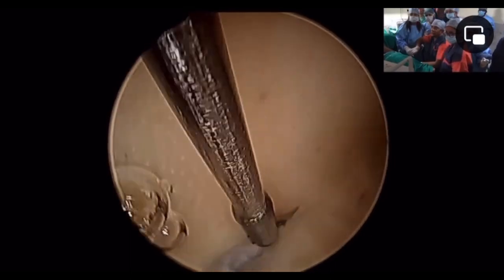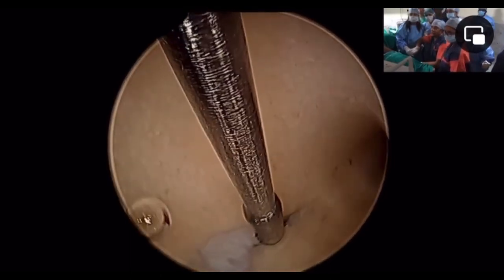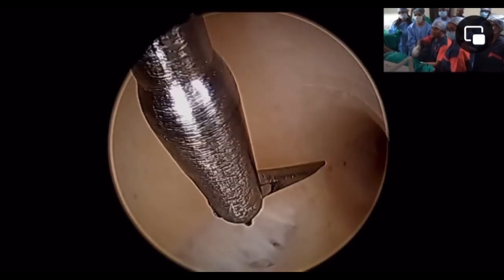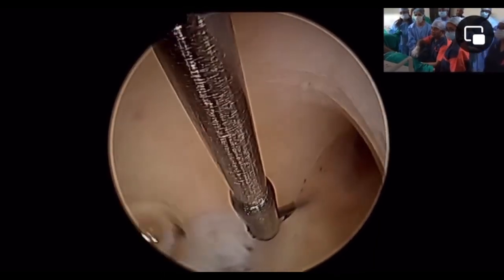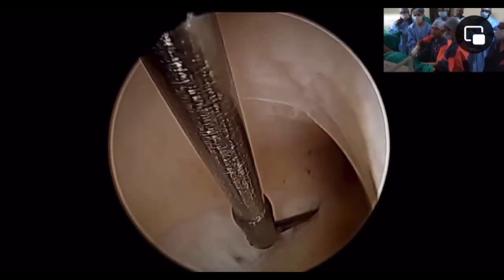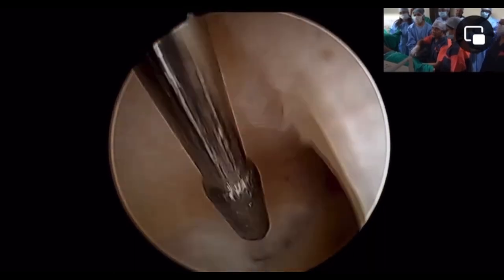Things seem impossible until somebody is able to do it, and then everybody can do it safely and competently. So here I'm using a unique, exceptional technique to deal with deep intramyometrial pathology using the scissor. The idea is to open a window through the uterine cavity and safely approach the area inside the myometrium, and then dissect, cut, resect, enucleate this pathology, whether it's a myoma or an adenomyoma or whatever it is.